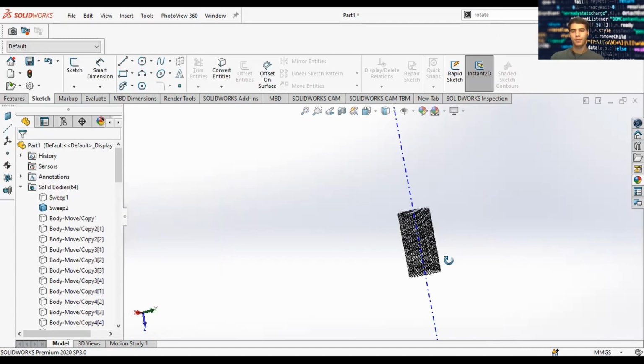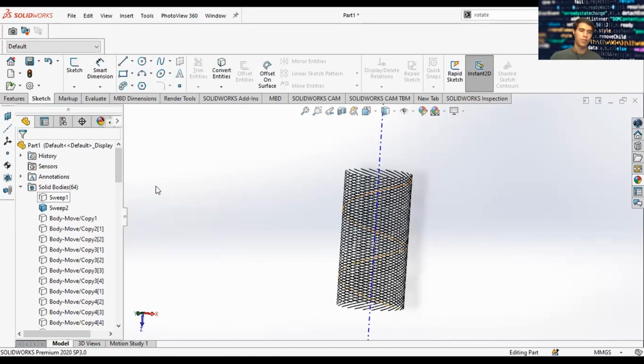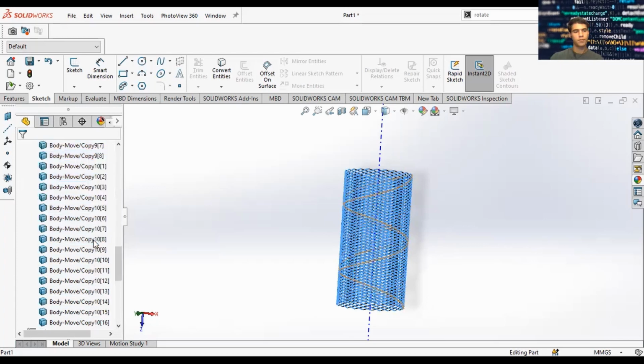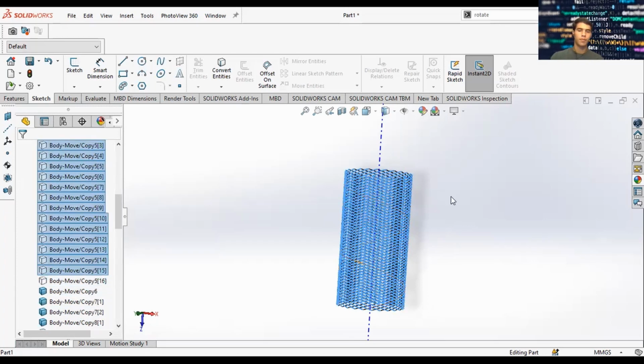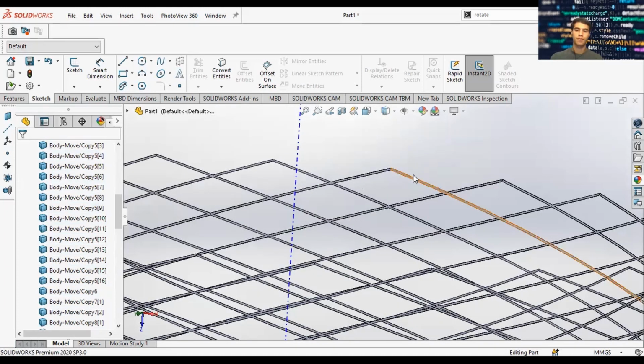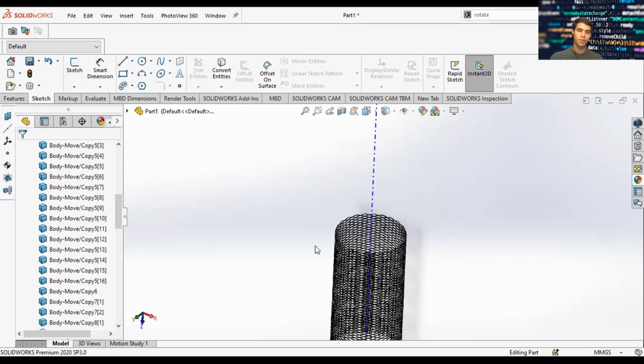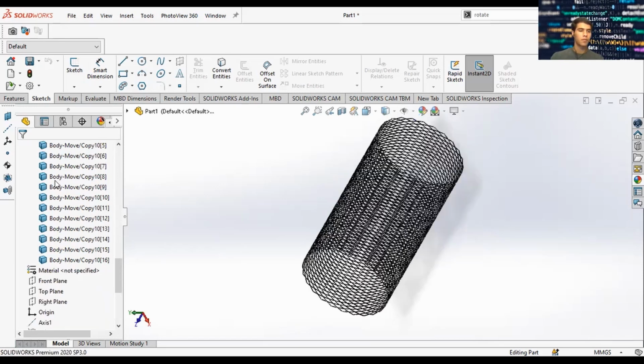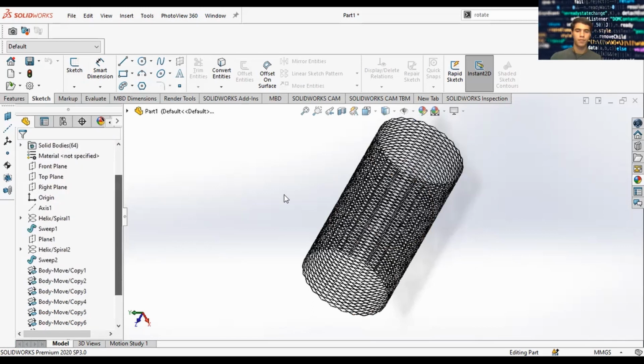And now we have the other orientation. So what do you do next? We're going to bring all of it back together. Here's your lattice. It's annoying. And there's your braid design. So this is an embolization device, 5 millimeters in diameter, 10 millimeters in length.